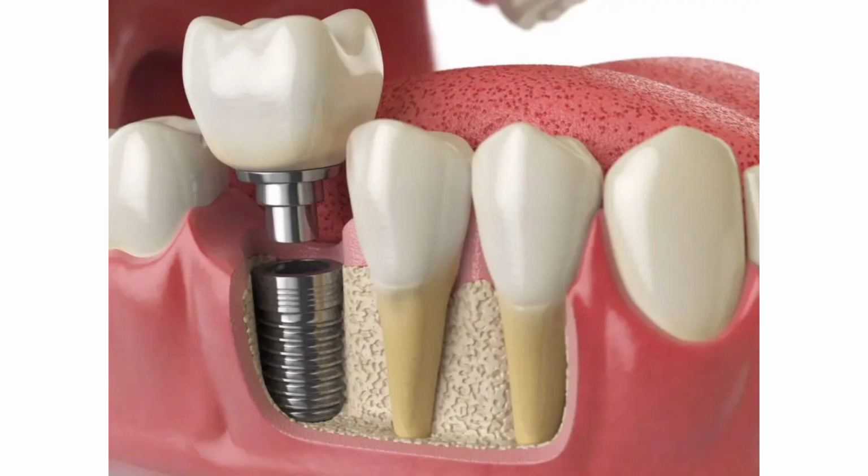Any dental issues like fillings, root canals, and scalings are performed prior to an implant surgery, based on clinical, radiographic evaluation, and 3D scans. Bone grafting is required when there is inadequate bone available for implant osseointegration. It is performed at the time of extraction of the offending teeth or at a later date, about 3 weeks after healing of the extraction sockets.